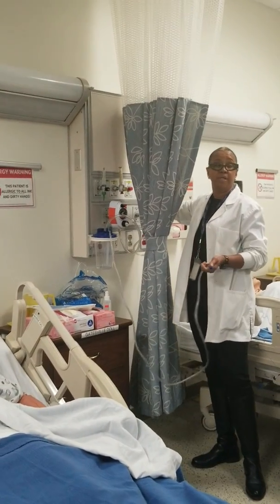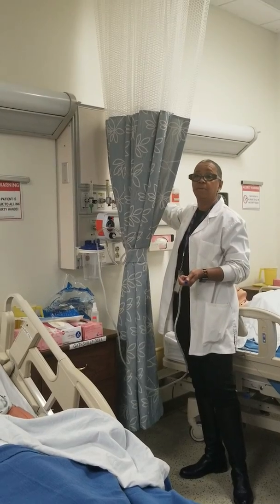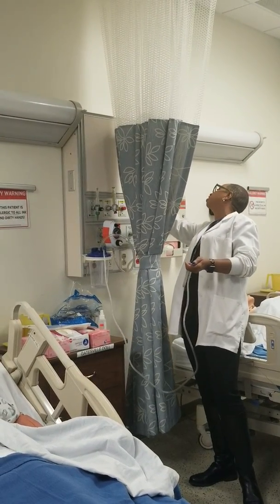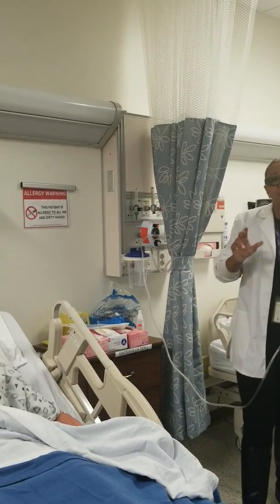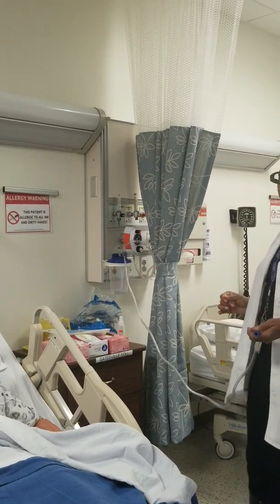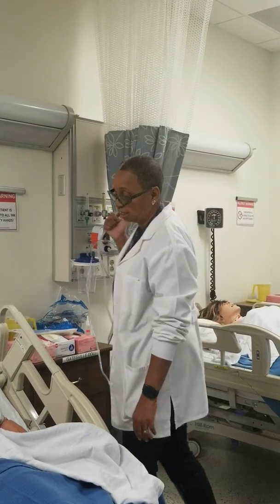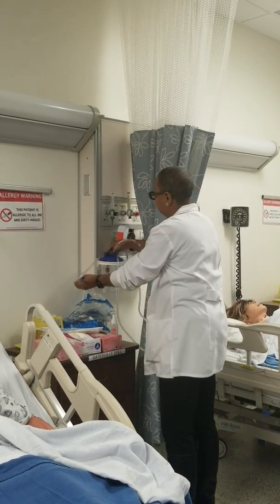So you should be able to hear suction in your room. Suction is loud. You can come in right away and tell if the suction is on or off. Pay attention. It's not that loud, but pay attention to the sound in your room. You can tell right away if it's on or off. So like I said, once again, you test your suction to see if it's working. So that's the suction.